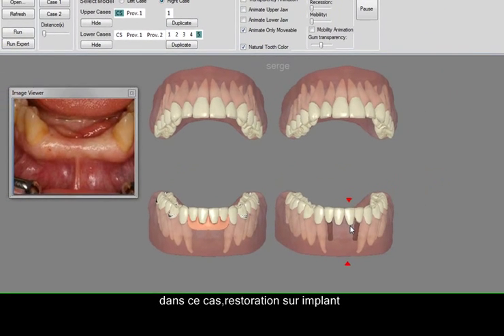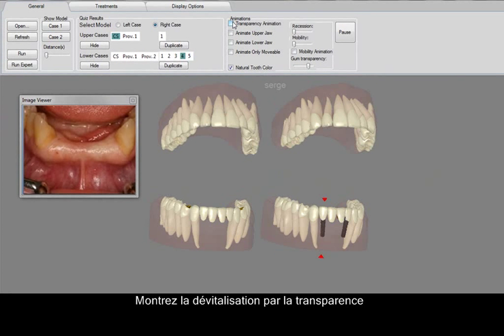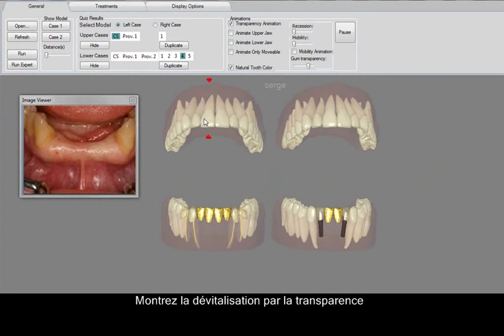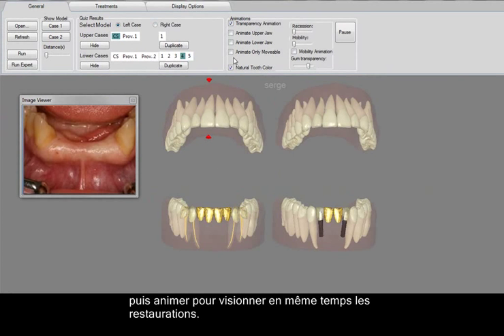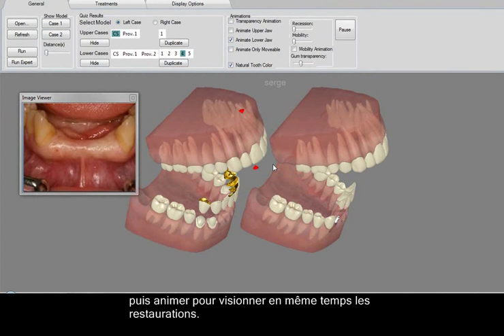Display the root canal by transparency, then animate to view both restorations and the insertion of the crown.